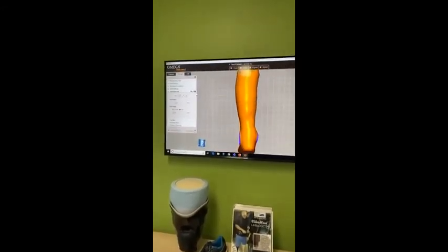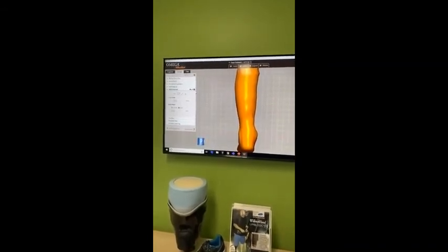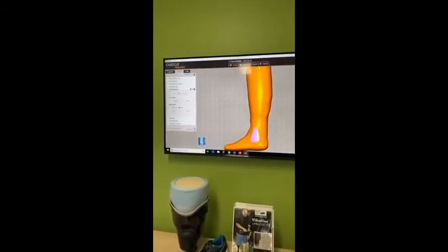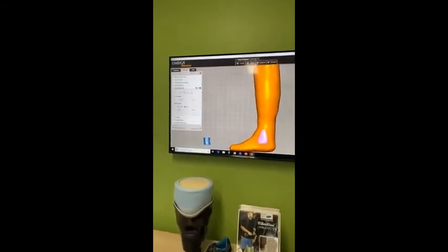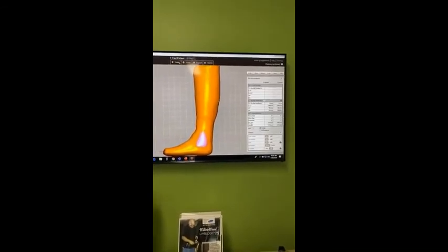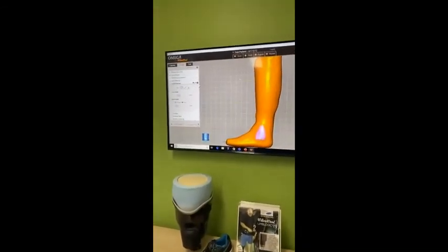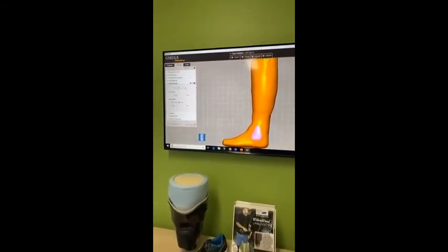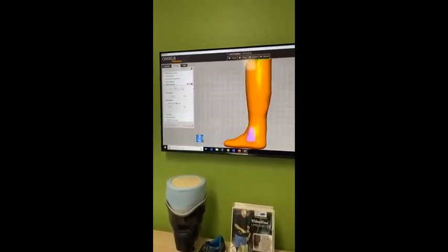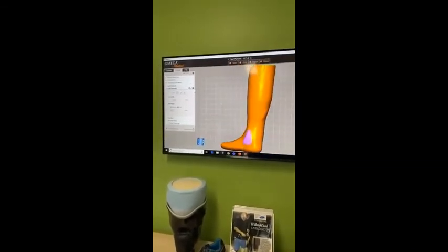You've got your colour mod over here, so you can turn that on or off. I like having it on, so you get to see the modifications you've done. Always save. Software can crash, so it's always good to save your modifications, like with any program, whether we use an accounting program, MYOB or Office 365.